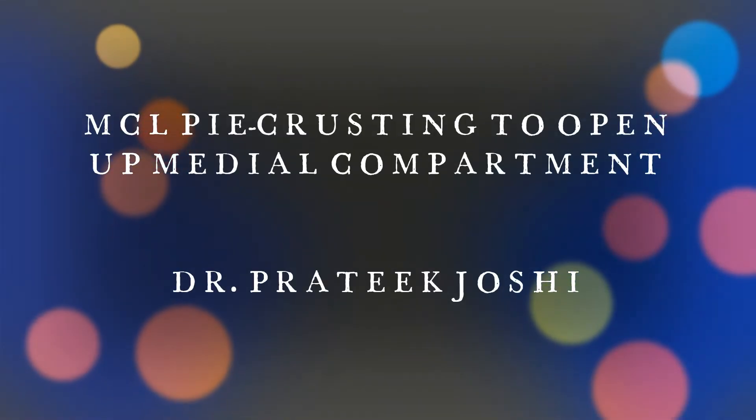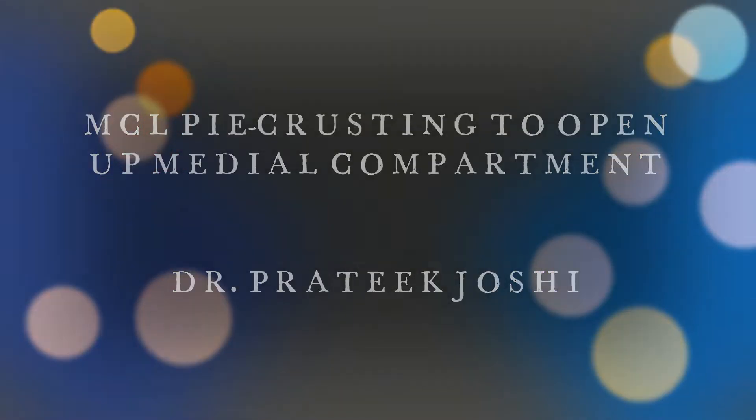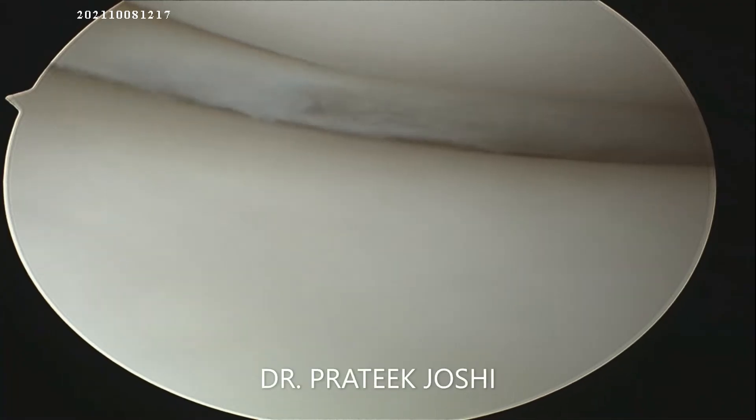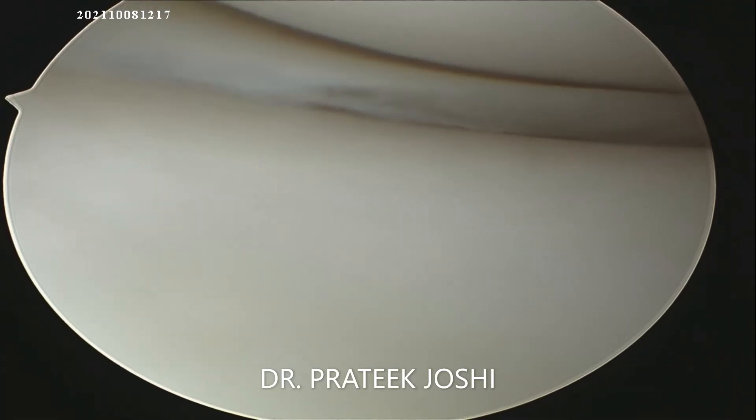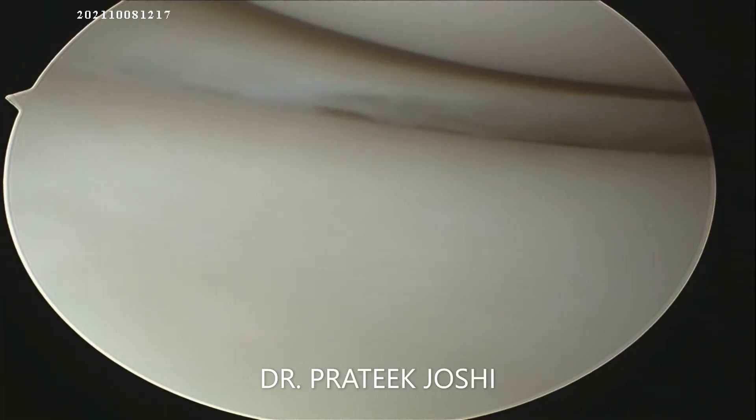Hello everyone, I am Dr. Pratik. Today we have a case of a young patient with bucket handle medial meniscus tear with a very tight medial compartment. In this case, we are going to do MCL pie crusting to open up the medial compartment so that we can repair the medial meniscus tear.